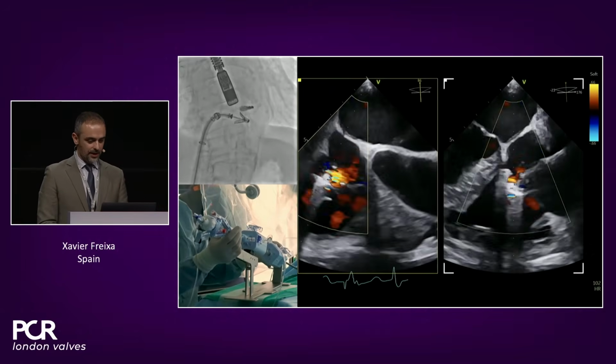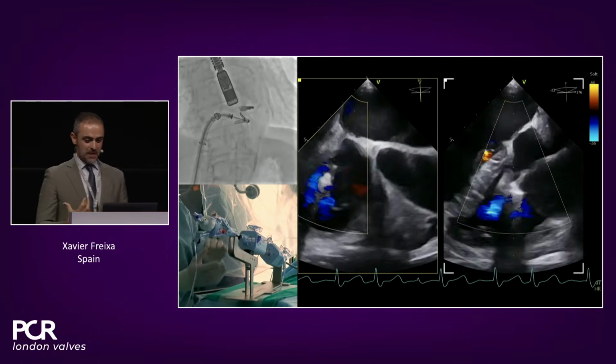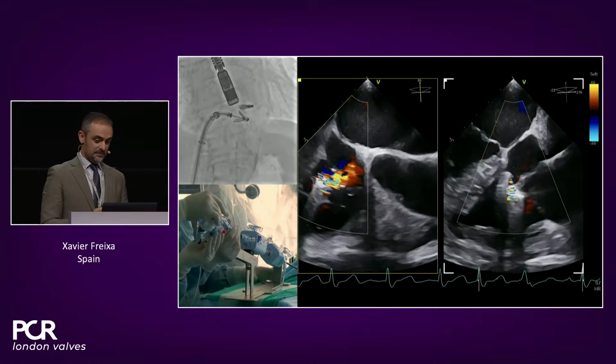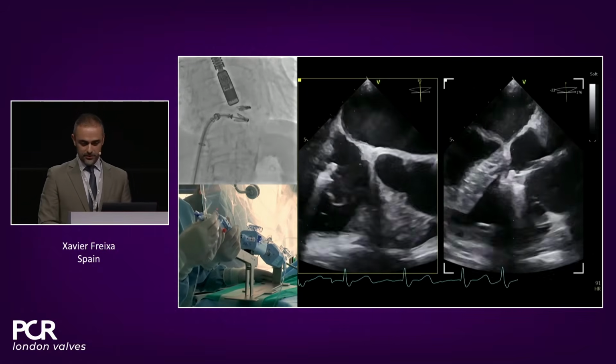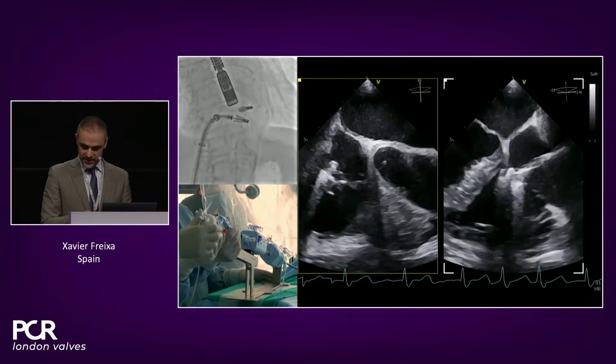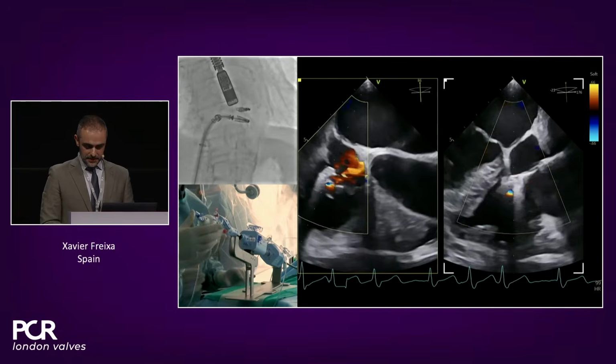And we check the color. And something again surprising happens. The color result is maybe worse now than before. But now we have more tissue. We have what we wanted. It doesn't look like a lot of tension.